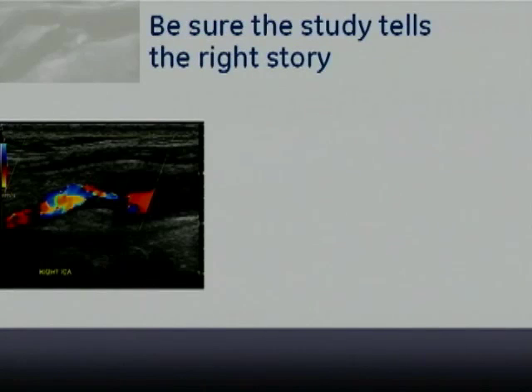We also want to make sure it's telling the right story, again, that everything is making sense beyond just taking Doppler samplings in tortuous vessels or coils. This is a case that was done by one of my students, and after she did the study, she asked me to help her because she was concerned that maybe she hadn't really told the entire correct story.